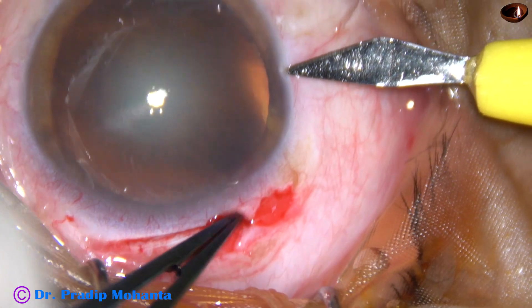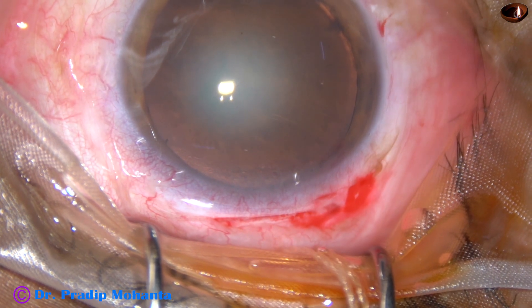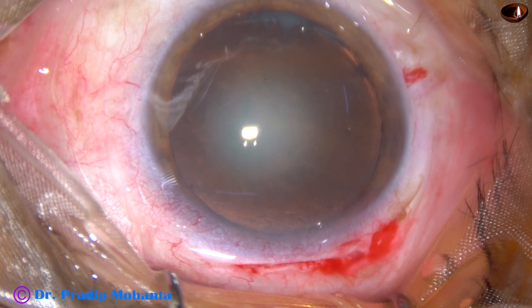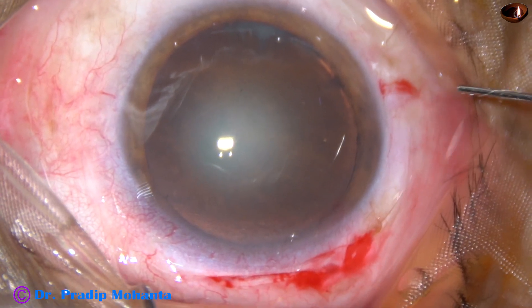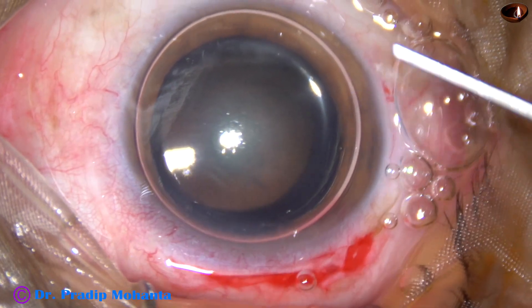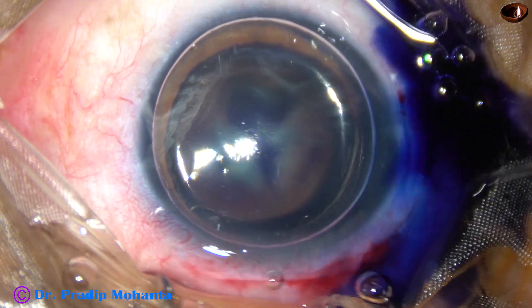This is the side port at around 8:45 o'clock. Beginners can take help of trypan blue dye for doing capsulorhexis, but we should not be dependent on trypan blue dye and should be able to do it without dye in most cases.